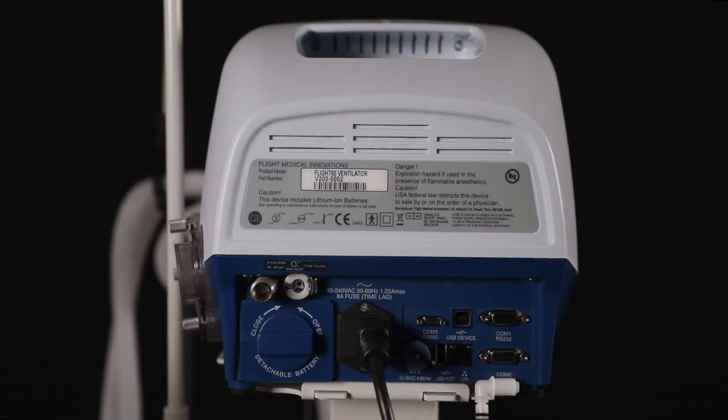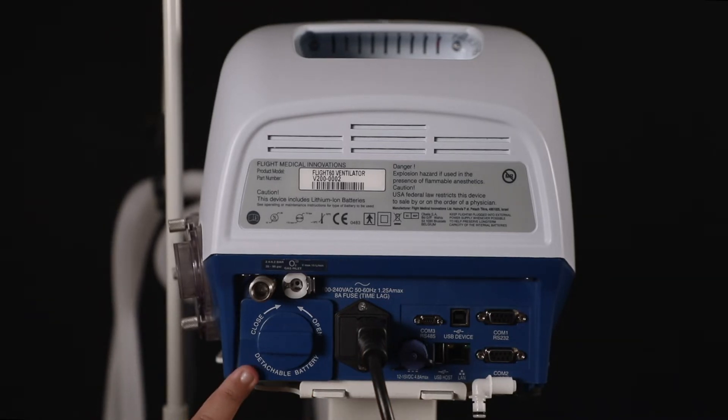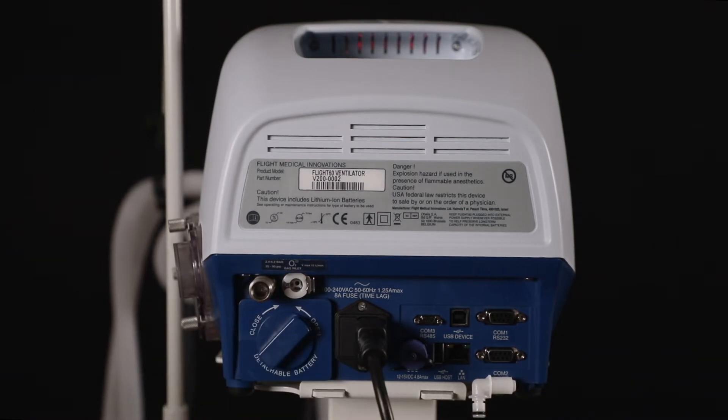On the backside you will find various connections and knobs. The power supply connection has a power cord, and the knob on its left is used for swapping batteries. The Flight 60 ventilator has two batteries. The user will have to rotate the knob in this manner and pull it out for swapping the batteries.